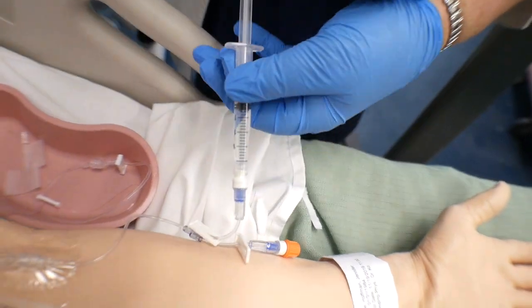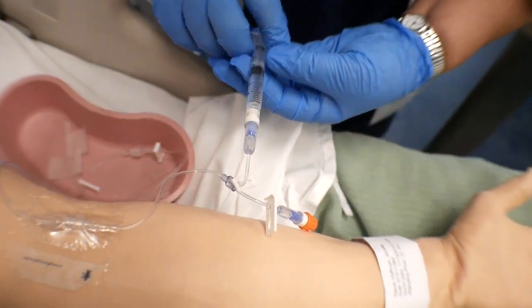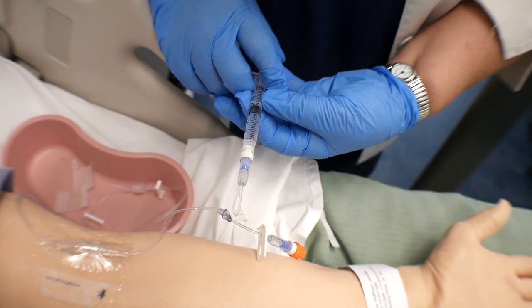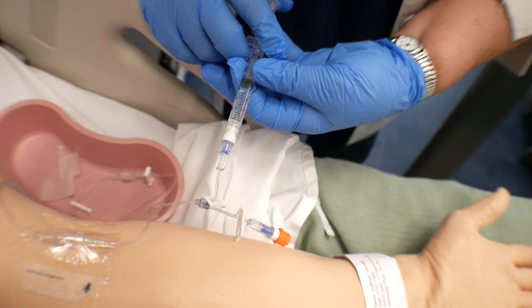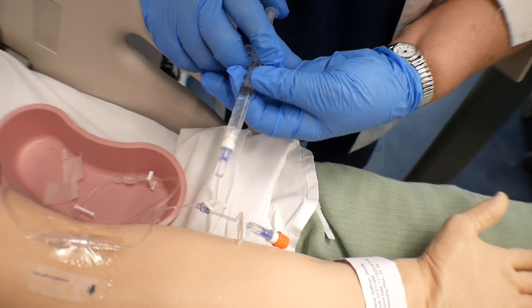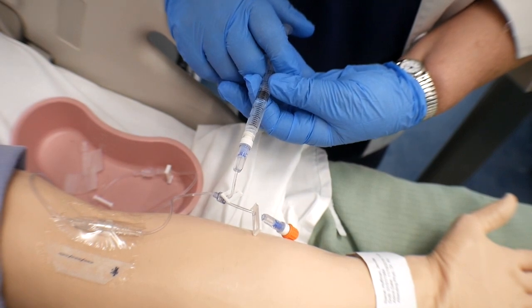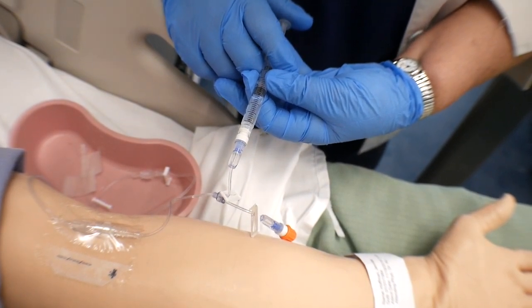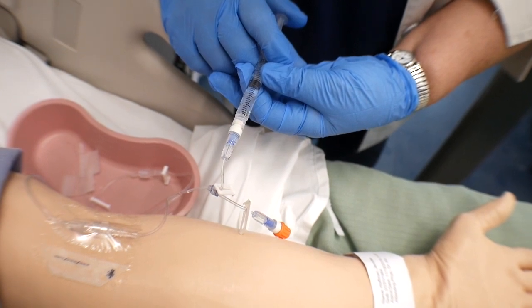So I can turn my watch around so I can watch it as I'm pushing, or you can count out loud, which some students will do. So I'm usually going to start right on an even number. So I'm going to start on the 6 for my watch, and then you'll see it as I push it. So I'm going to go to the 5.